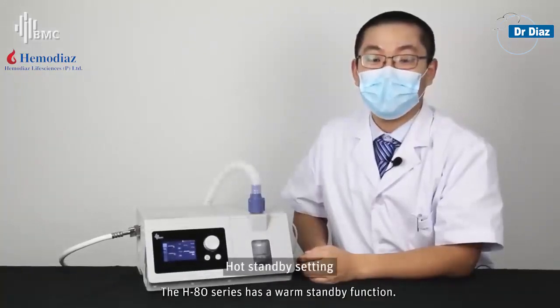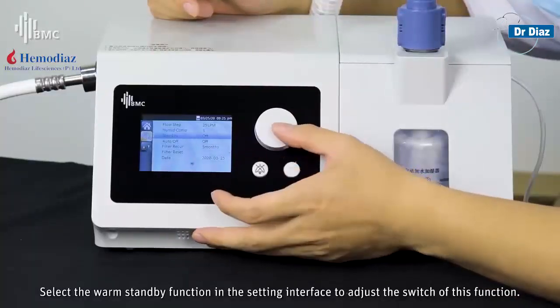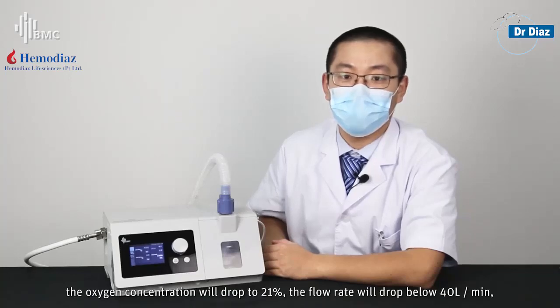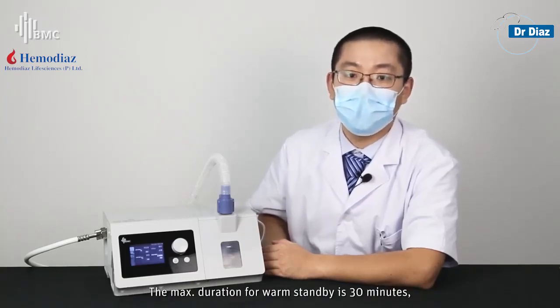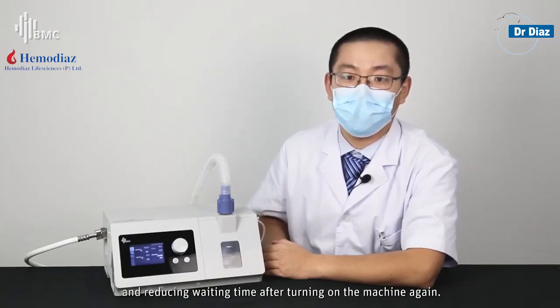The H80 series has a warm standby function. Select the warm standby function in the target settings interface to toggle this function. After turning it on, when the patient removes the nasal cannula, the oxygen concentration will drop to 21% and the flow rate will drop below 40L per minute while still maintaining heating. After the patient resumes wearing the nasal cannula, normal working conditions will be resumed. The maximum duration for warm standby is 30 minutes, allowing treatment to be started quickly after a short absence and reducing waiting time.